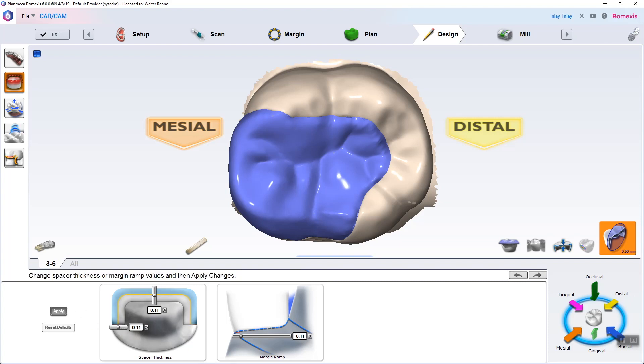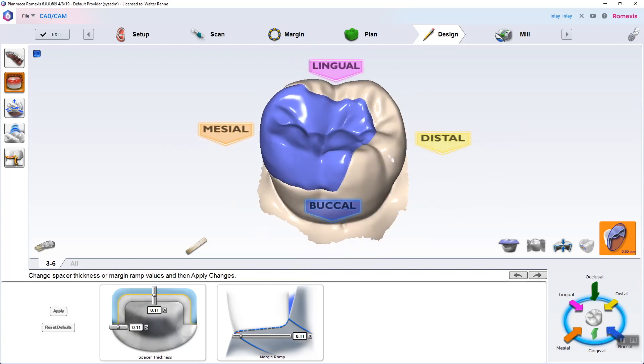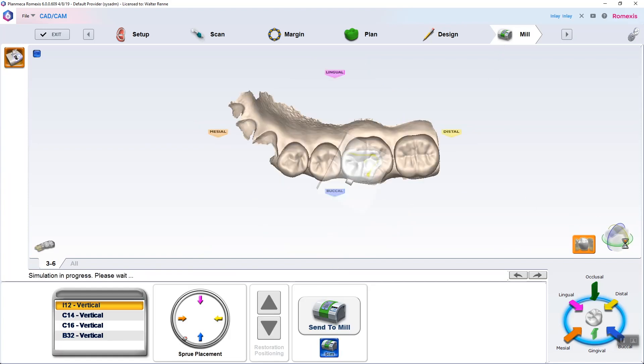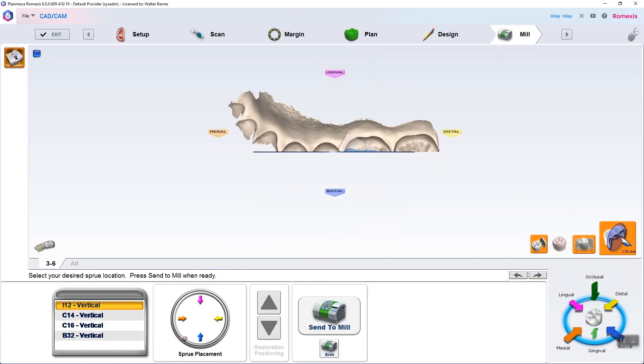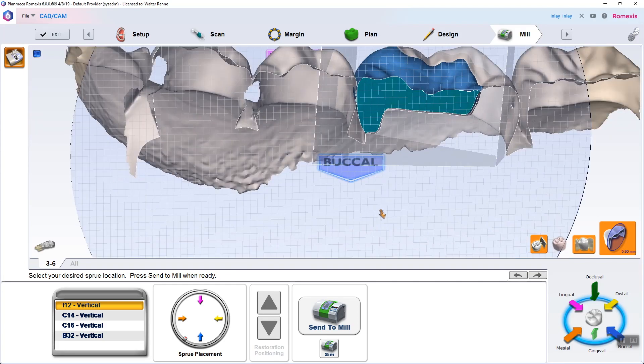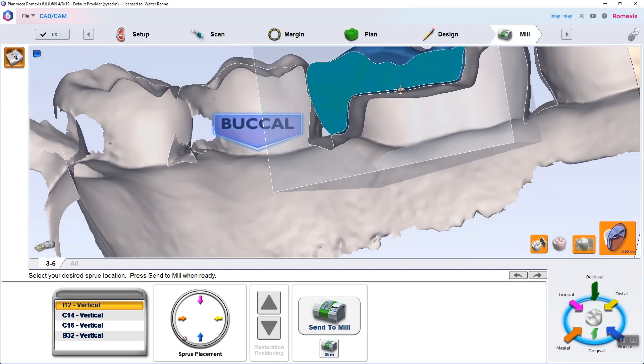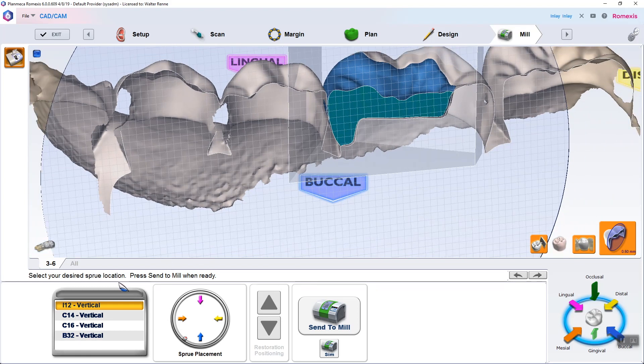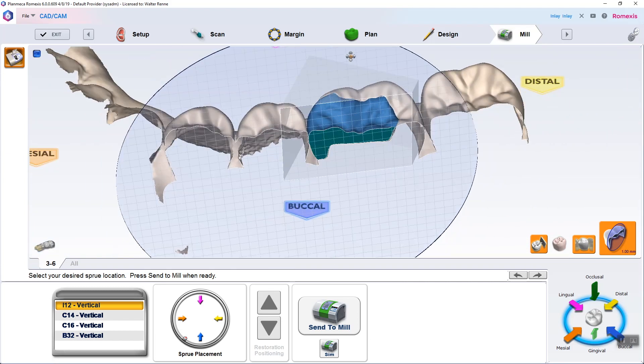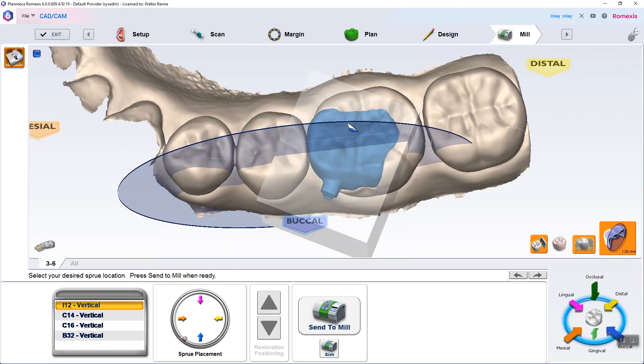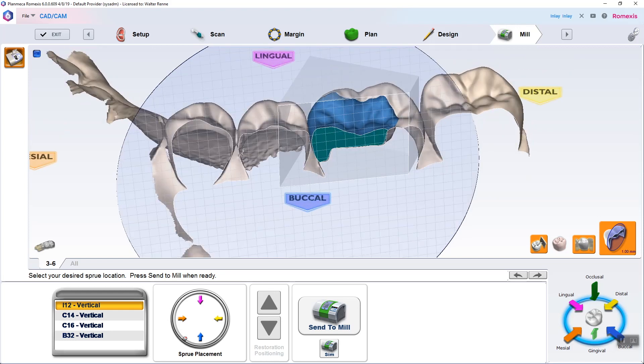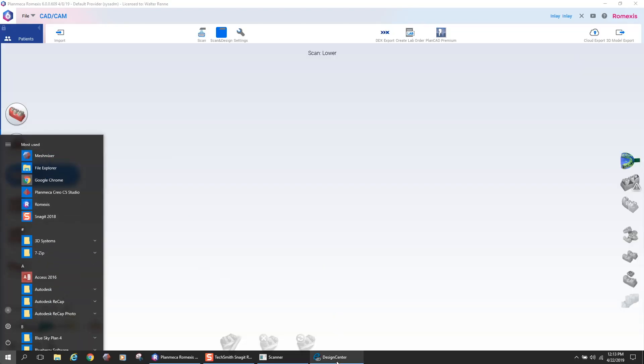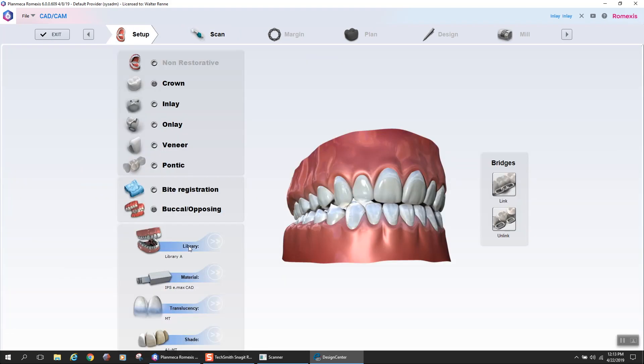You just don't want your margin ramp to be a lower value than your cement space. So if your margin ramp is 0.1, let's say 0.1, you don't want your cement gap to be less than 0.1. So that's why I boosted it up to like 0.2, extra 100 microns there. So now I'm going to look again. Let's take a look and see what we got. I like that better than what we had before. Good potential for the restoration to bond.